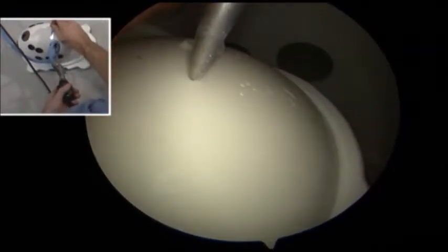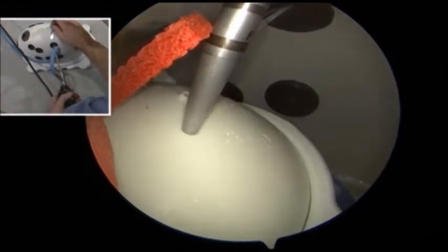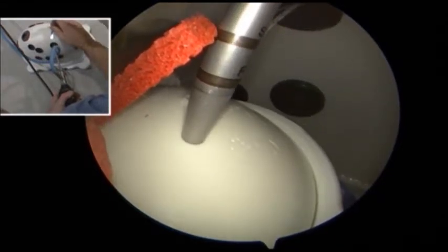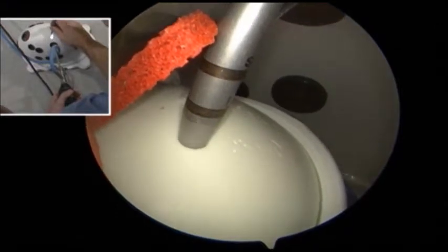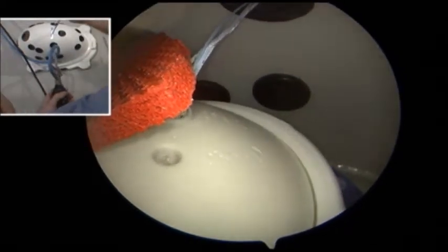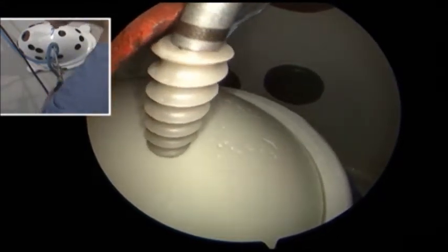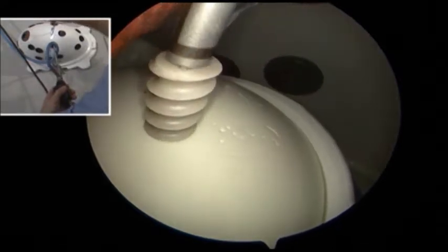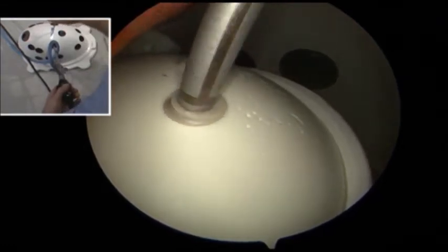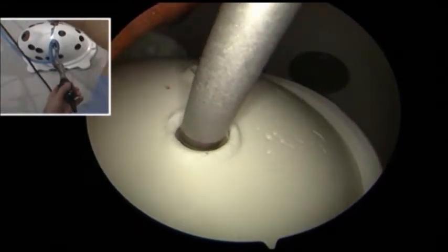So again, we try to get that 45-degree angle, and we'll tap this home. And again, we're going just short of the laser line in this model, but in somebody with good bone, you would go and seat it fully to the laser line. We're inserting the anchor again. Here we're at that cortical margin. We're going to go just below, probably 1 full turn, perpendicular to the cuff.